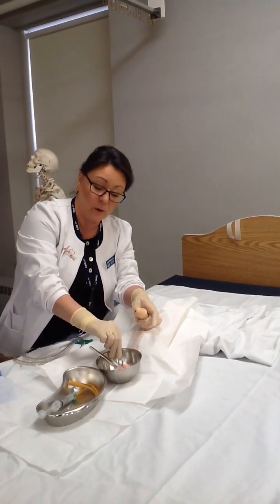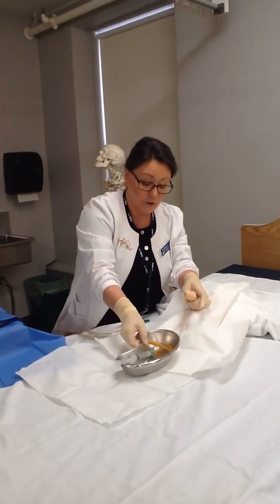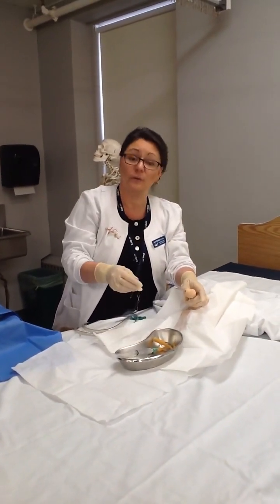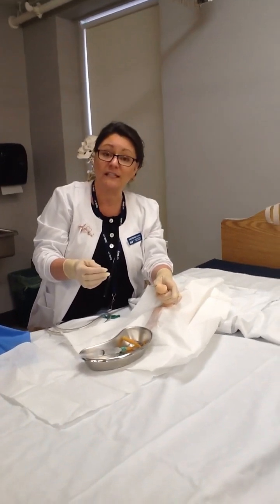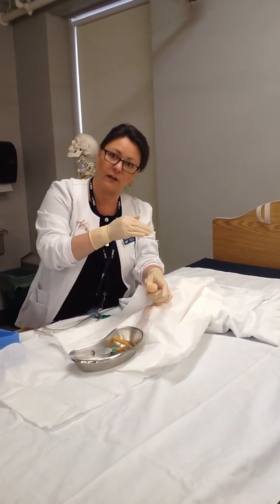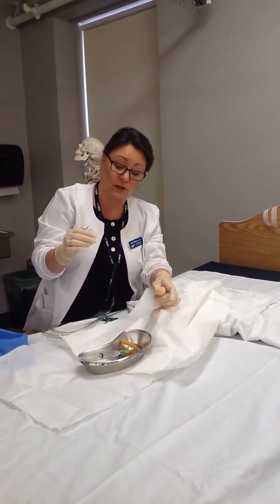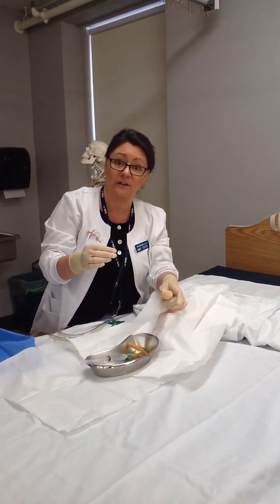We can pick up the bowl and move that right out of our way. And now we're going to insert our catheter. For a male, we're going to insert 17 to 22.5 centimeters until we see urine, because it's a much longer path all the way up to the male's bladder. Then, once we see urine, we're going to insert all the way to the bifurcation.